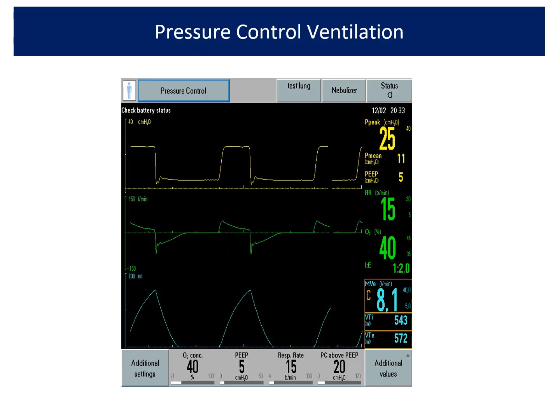So this is pressure controlled ventilation. Here you can again see the pressure, flow and volume. Here the flow and volume is what we are really interested in. Pressure we know what it will be, right? What you can see here is a decelerating flow pattern with a peak expiratory flow here and everything is good. So you have put a pressure control of 20 above PEEP.